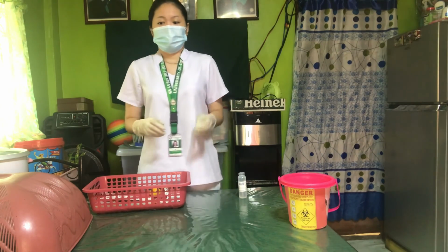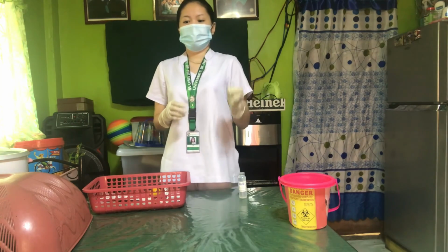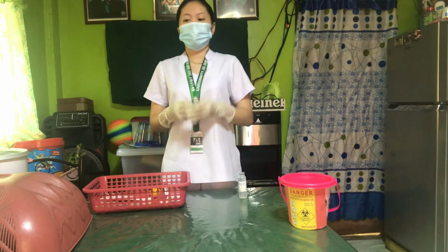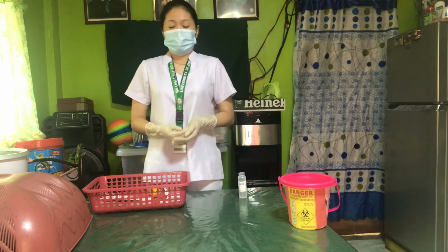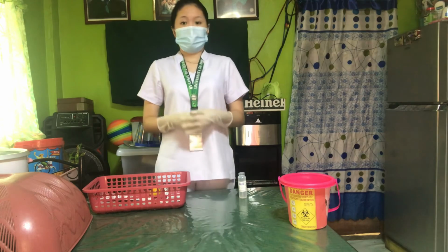And then, we will dispose this filter needle appropriately in the sharps bin so that no one will be injured, especially the patient or the collector of garbage. Now, we are done preparing the medication from vial and ampule.